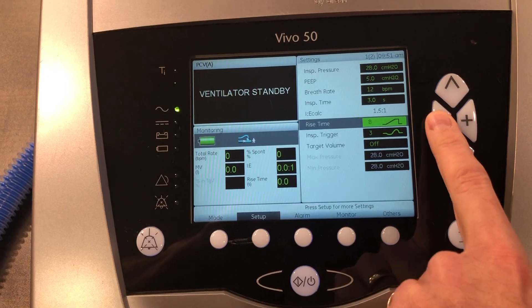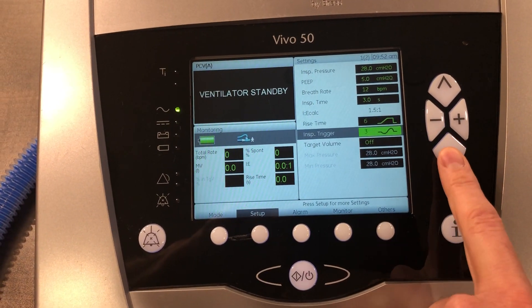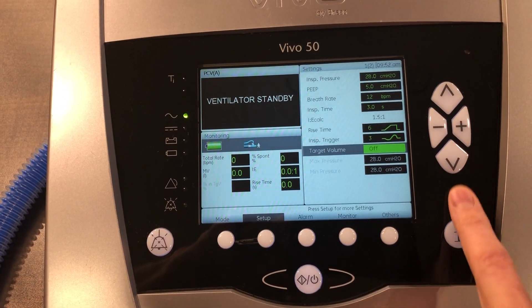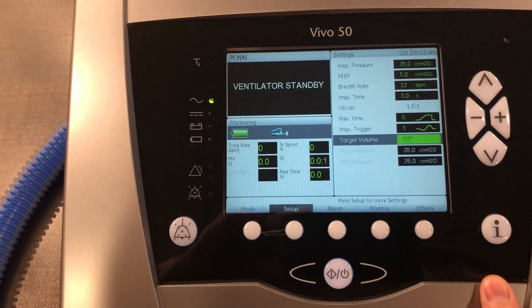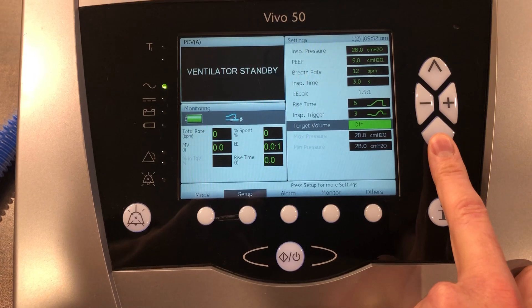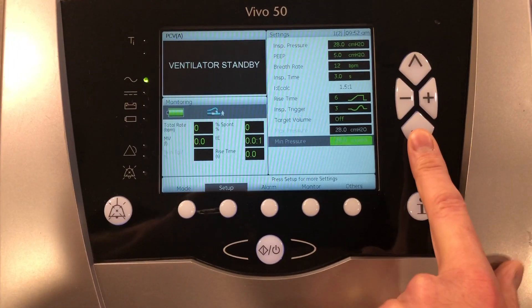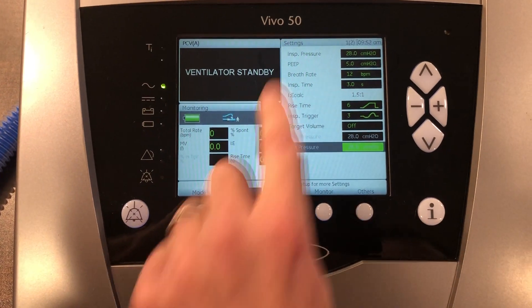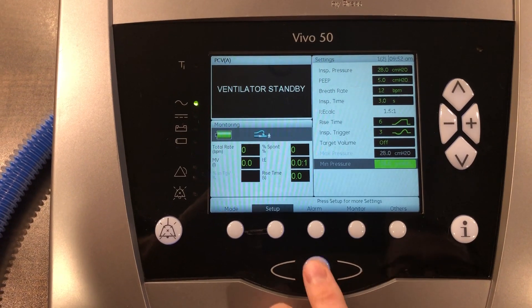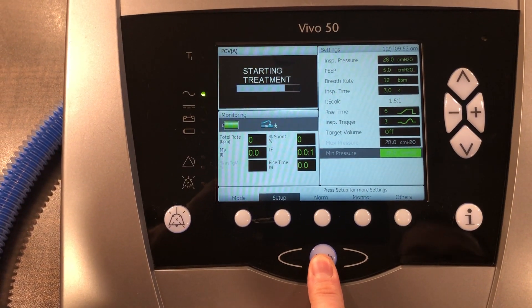I've got my rise time at 6. I'm going to leave my inspiratory trigger at 3. We're going to leave our target volume off for now. You can see our max pressure — min pressure is the same as what we set earlier at 28. So now I want to press this button here to start treatment. You have to hold it.